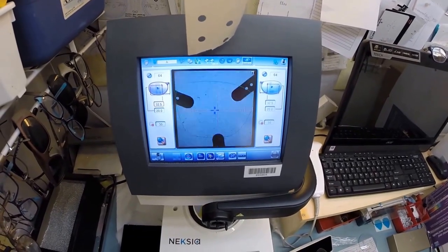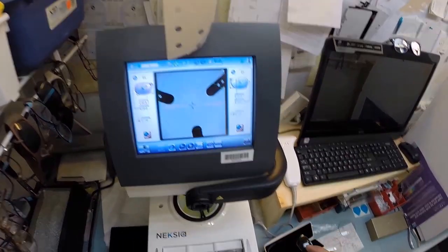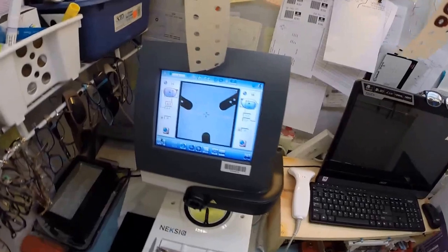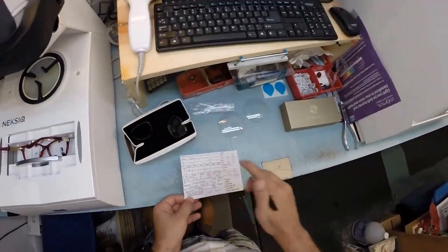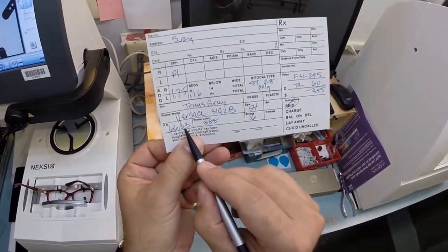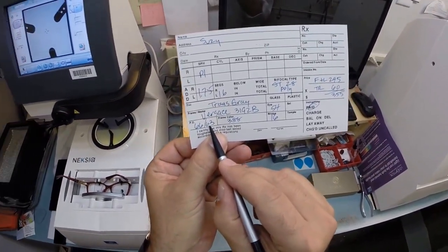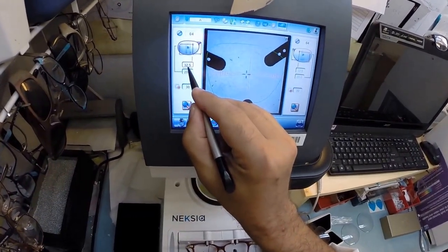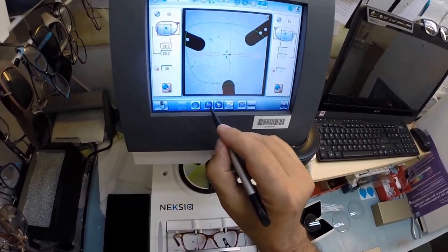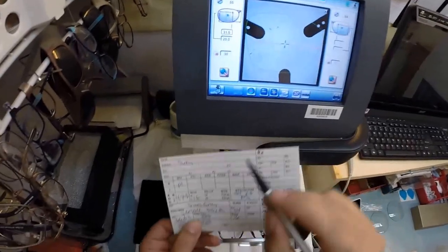And of course, Suzy, you have no prescription in the top of yours. You're just using this as reading glasses, a very nice pair of reading glasses. So your pupillary distance is 63, that's the near, which we're going to use for your bifocal power. So half of that is 31.5. The computer starts at 32.5, so I'm going to hit this minus button twice until 31.5.